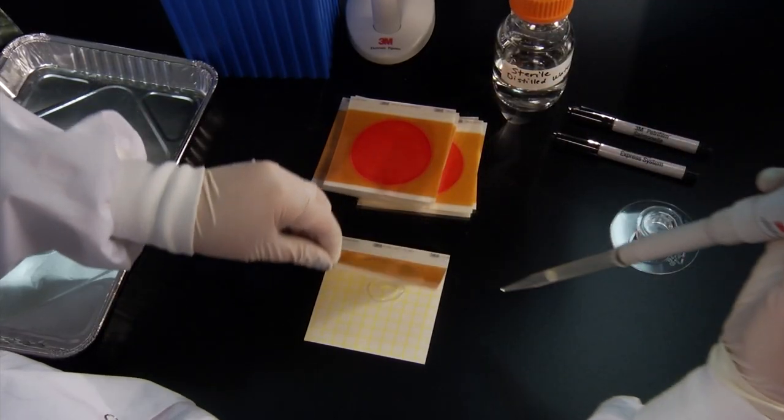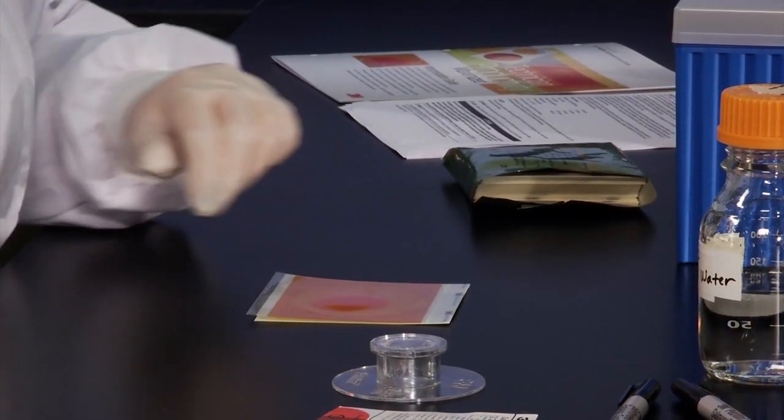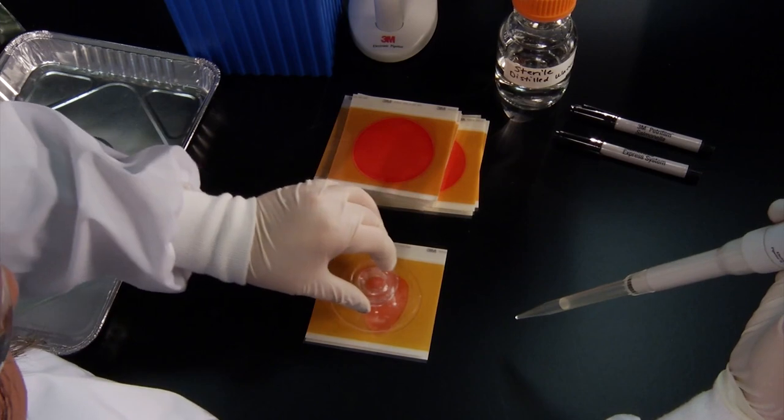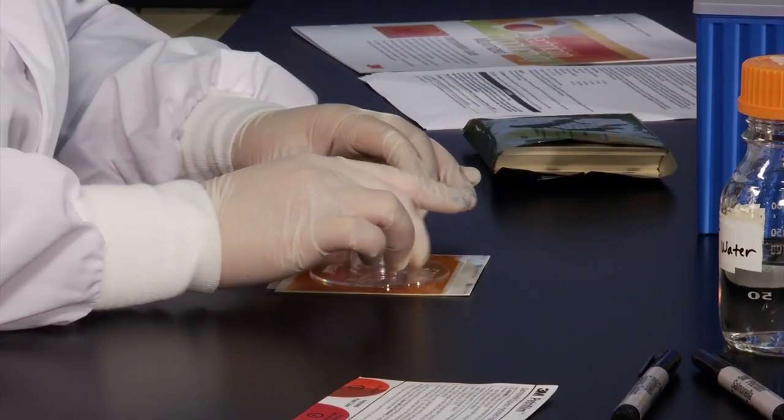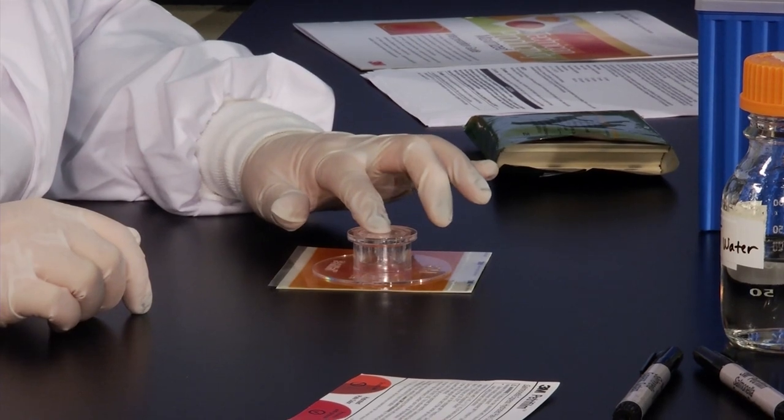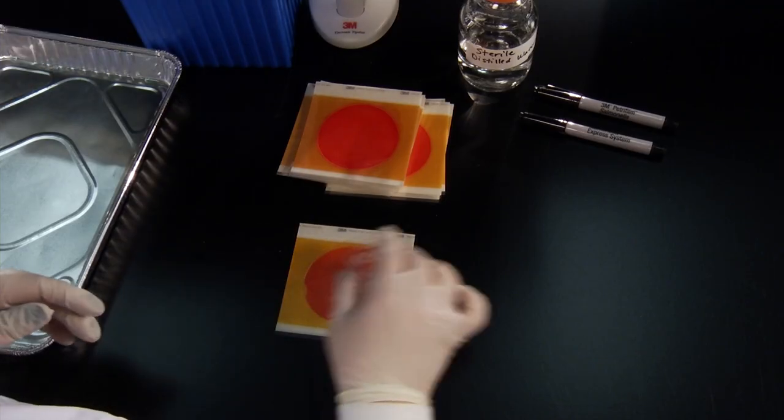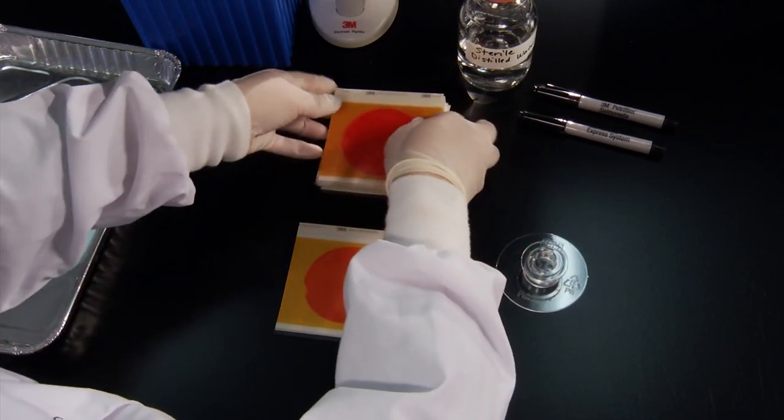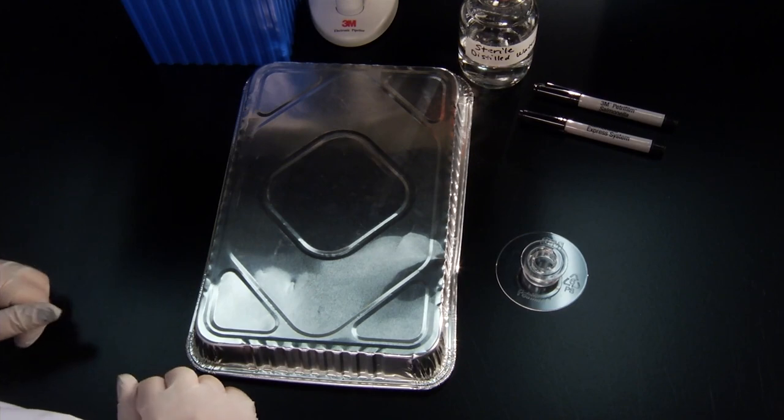Gently roll down the top film onto the diluent to prevent trapping air bubbles and place the 3M PetriFilm flat spreader on the center of the plate. Press gently on the center of the spreader to distribute the diluent evenly. Remove the spreader and leave the plate undisturbed for at least 1 minute.